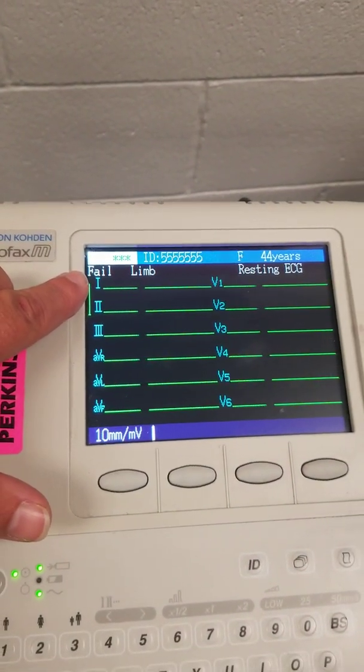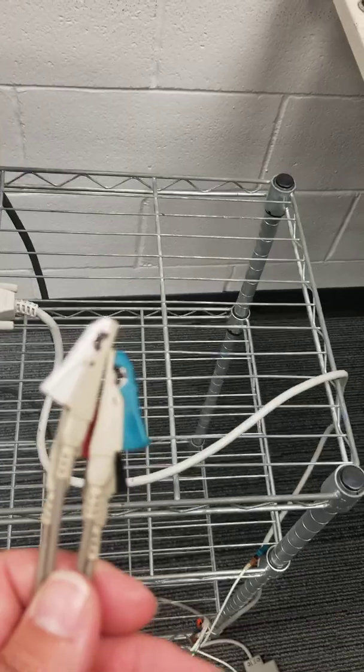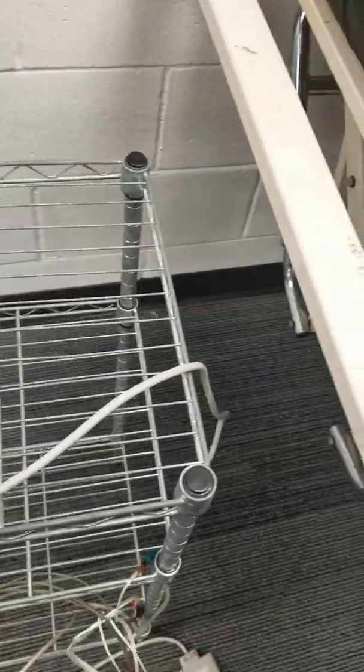This system here that says you have a fail limb means that these electrodes are not connected to your patient, so we're not going to be connecting them at this time.